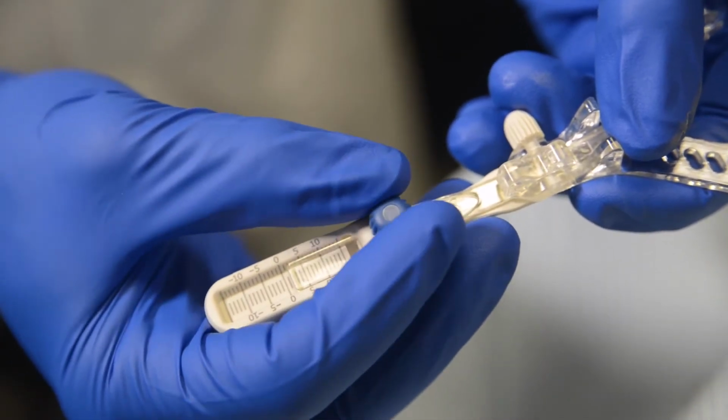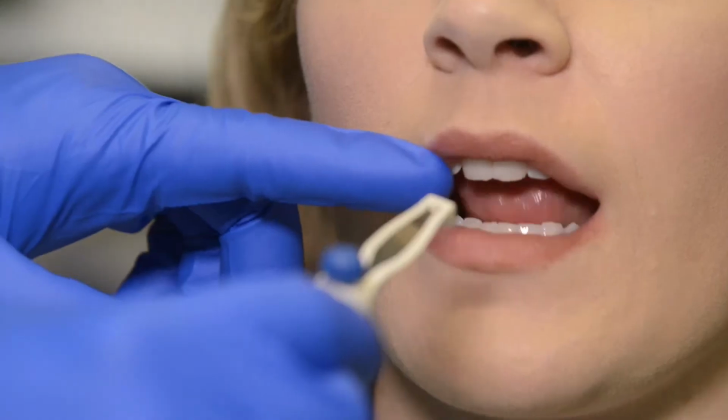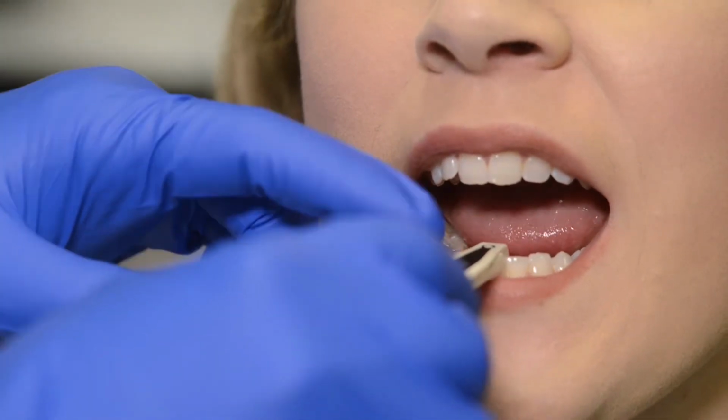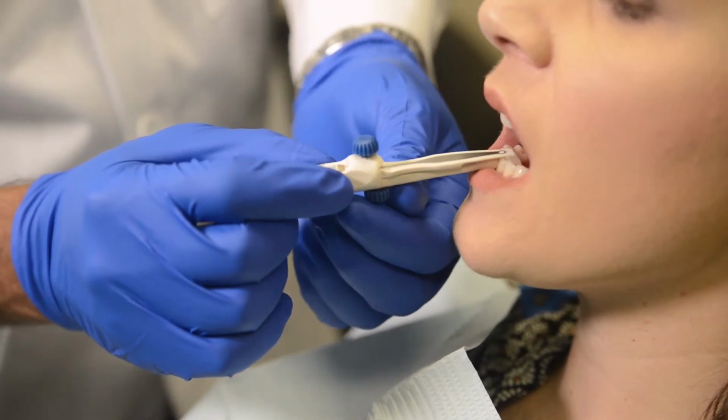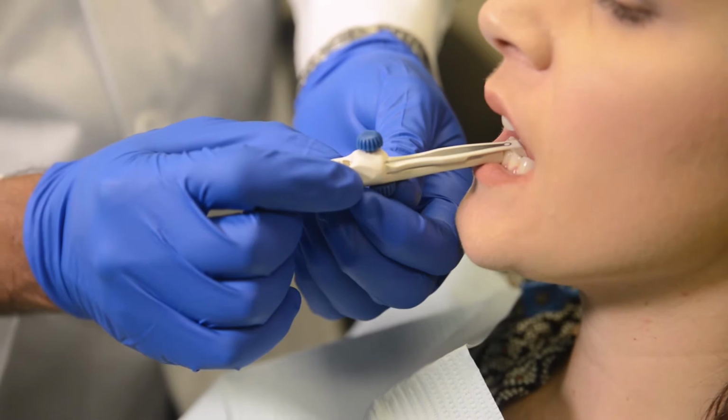Step 1. Loosen upper and lower screws and place the slider over lower incisors at the skeletal midline. Move the slider towards you to contact the lower anteriors, then tighten the lower screw to secure the slider.